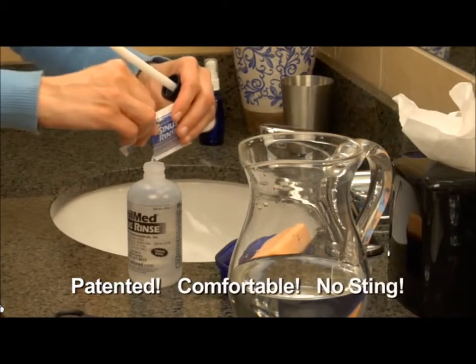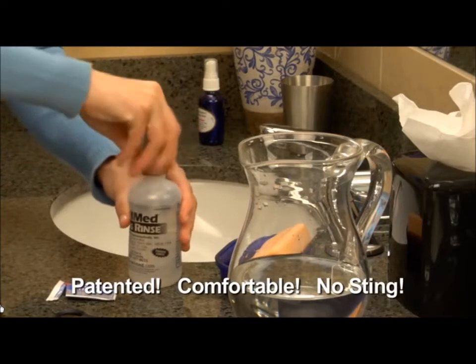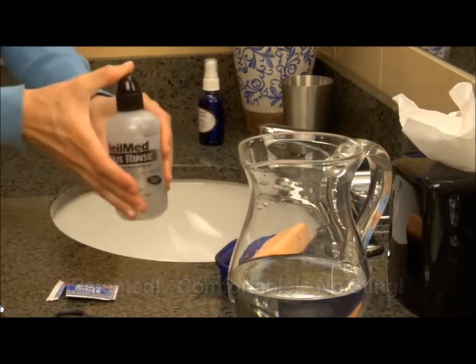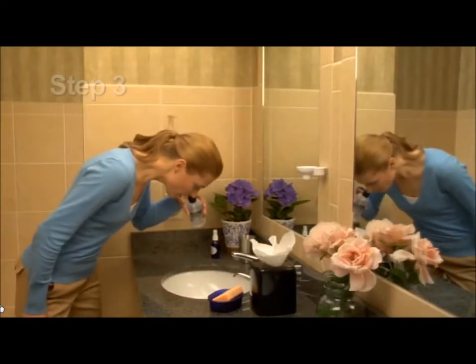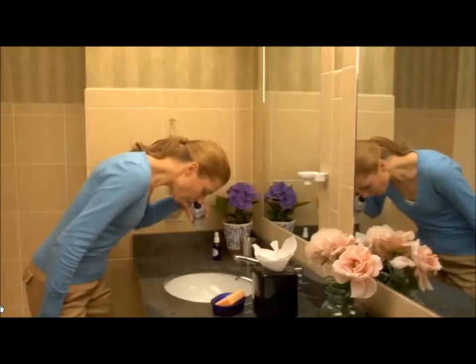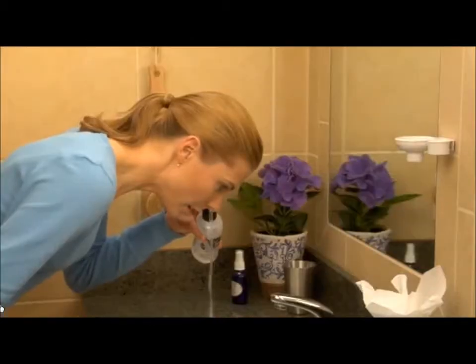Pour the packet contents into the bottle. Make sure you tighten the cap and tube on the bottle firmly. Put one finger on the tip of the cap and shake the bottle gently to dissolve the mixture. Standing in front of a sink, lean forward comfortably and tilt your head down, keeping your mouth open without holding your breath. Place the cap snugly against your nasal passage.